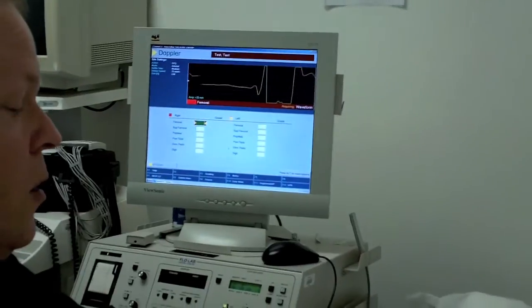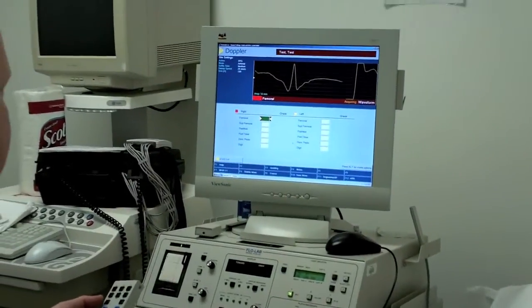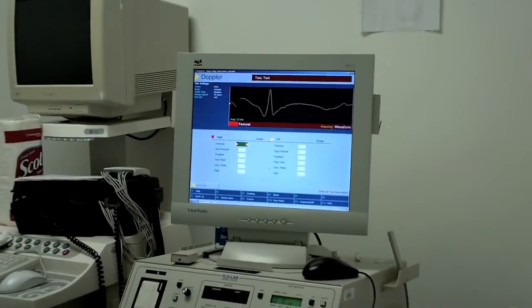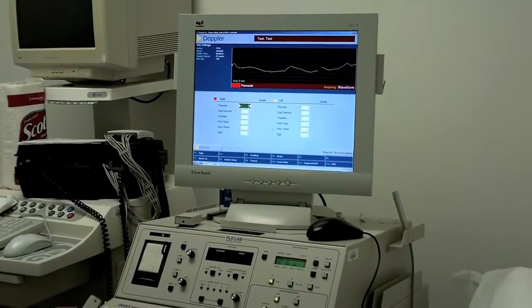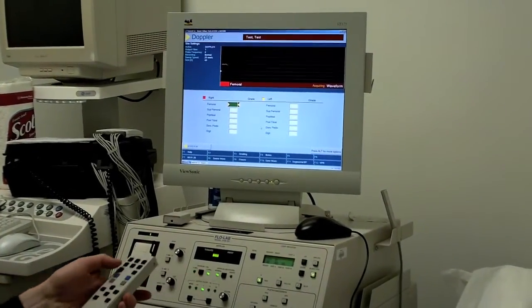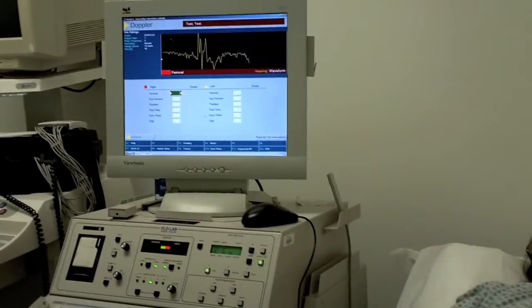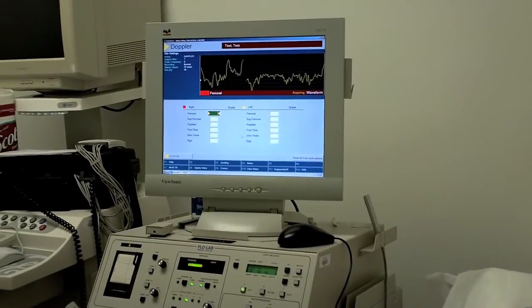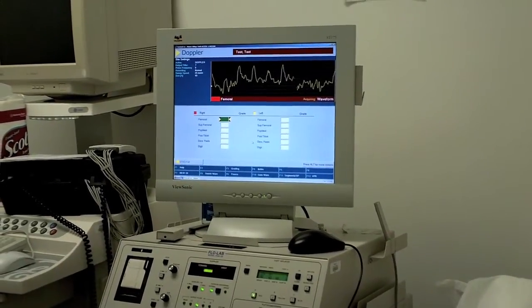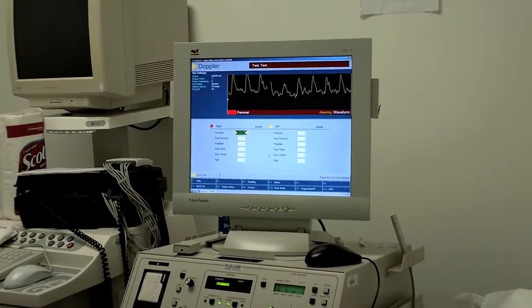So coming up here now, again, the common femoral, we're going to listen with our ears, and if we hear veins or such, just knowing our anatomy, right there we're hearing a vein. So that's telling me, since I know the vessels come out from the middle part of the body, vein, artery, nerve, more laterally, if I hear a vein, I'm going to move more laterally.